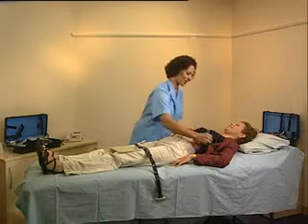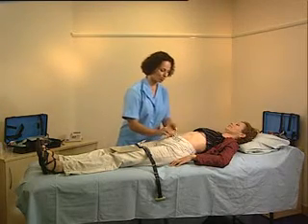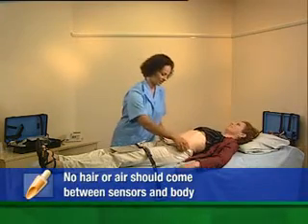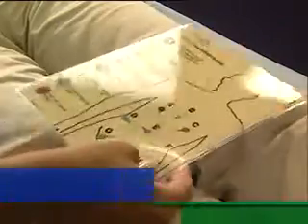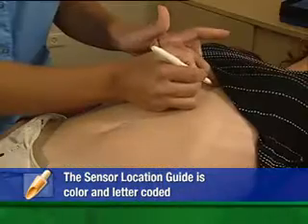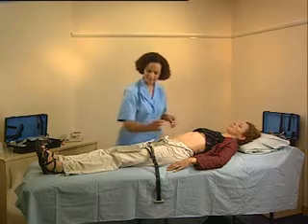Now it's time to attach the sensor array. Ask the patient to lie down and expose the stomach down to the pubic bone. If necessary, shave the areas where the sensors will be placed. It can be helpful to mark the locations in advance. The sensor location guide will show you exactly where to place each sensor according to its label and color.